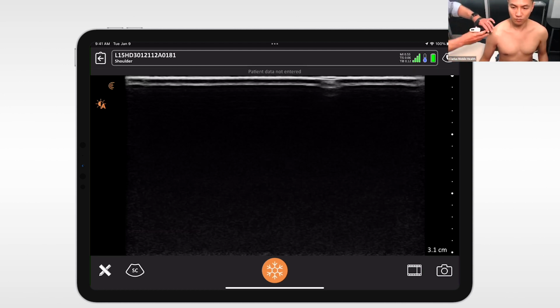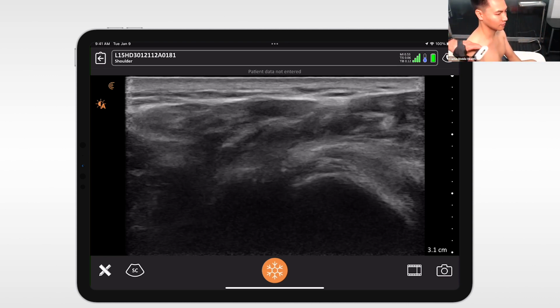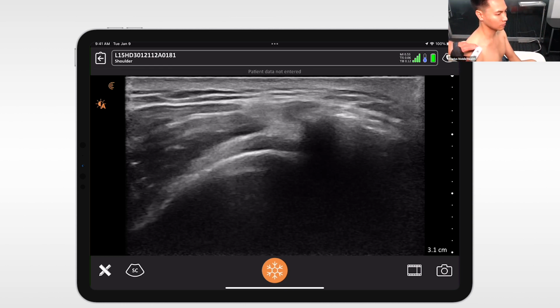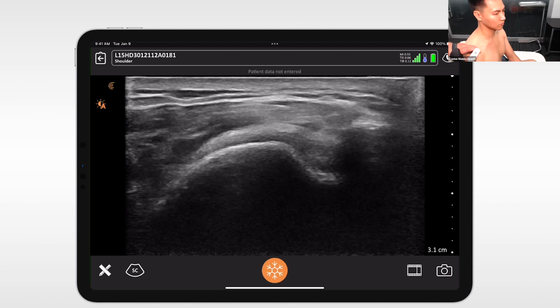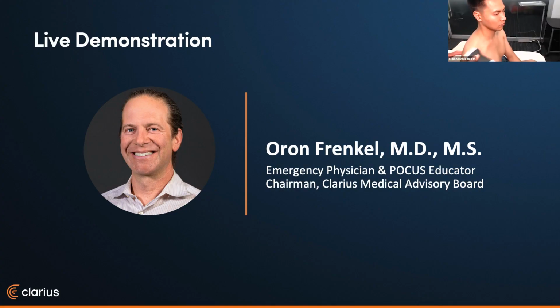I like behind. Yeah, maybe we could try that. Kind of coming from behind. It's certainly more ergonomically advantageous to come from behind. And then do the motion. Nice. Great. So I don't see too much pathology in that shoulder. Yeah, this looks like a healthy specimen.